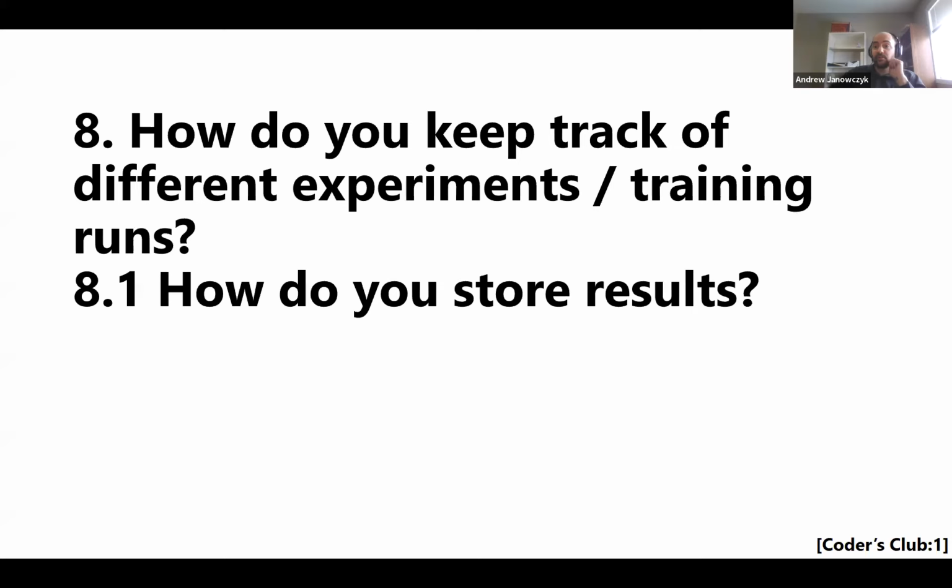And I agree with you. The startup cost used to be massive. I think it's finally starting to get better. But I would note, you still have to be super disciplined in order to do it well. Because if you leave that comment at the top of your script that says, try number 1, done, version 2, version final, regardless of how you organize the rest of that script, whenever you look at those comments, they're still going to be meaningless to you. Yeah, people are talking about Weights and Biases, or WANDB, however you say it out loud.